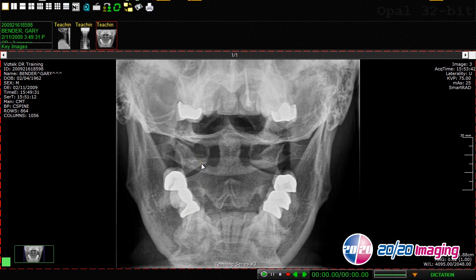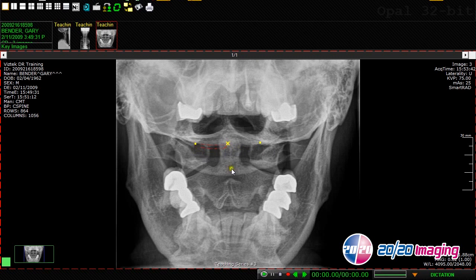The center point tool can be used to find the exact center between two anatomical points that you place on an image. For example, if you wanted to find the center of the foramen magnum, you could click on the left medial aspect of the condyle and the right medial aspect of the condyle, and the software generates an exact center point between these two anatomical points.